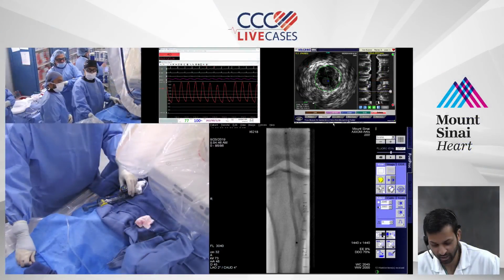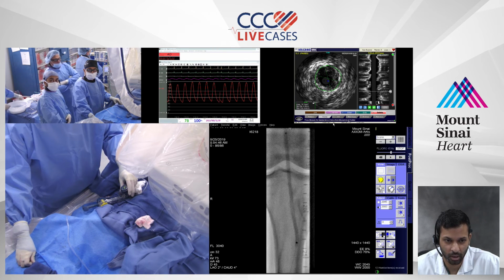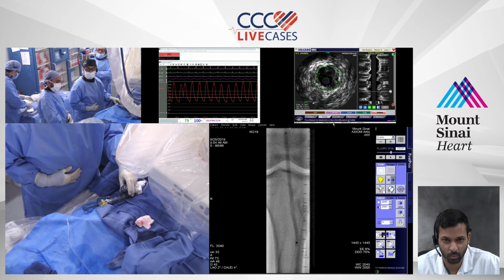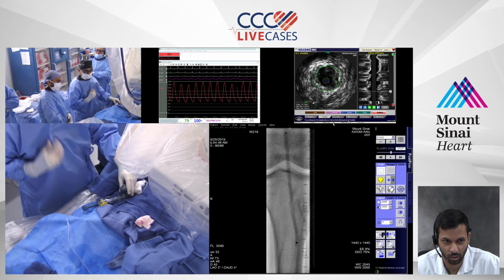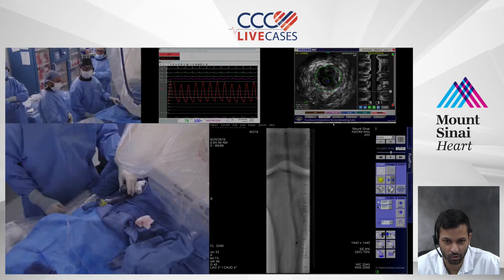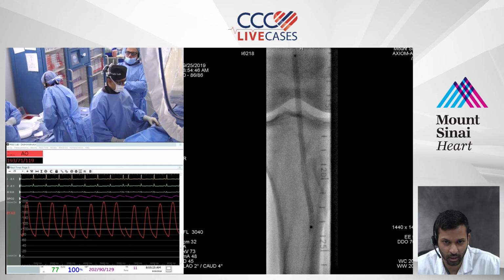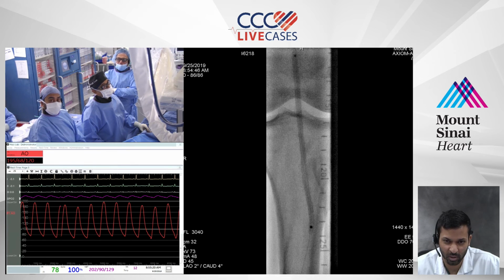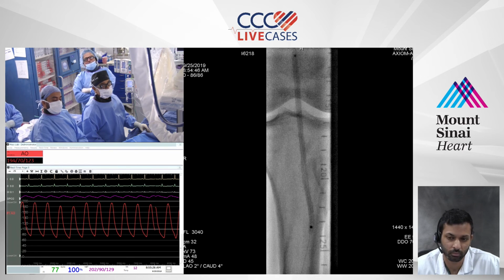Yeah, I think you kind of hit on it. Some of it's preference. For me personally, I'll see the patient 2 to 4 weeks post-op, and generally get a repeat ABI or arterial duplex then. Depending on what I find will determine where the next study is, but generally it'll be 3 to 6 months if everything looks okay. And then I keep it in that range, depending on what the symptoms were and the risk for restenosis. In this patient who has very complex multi-level disease, I would follow him closely for sure. But my first imaging would be within the first 2 to 4 weeks. Got it. And then what is your criteria to re-intervene?